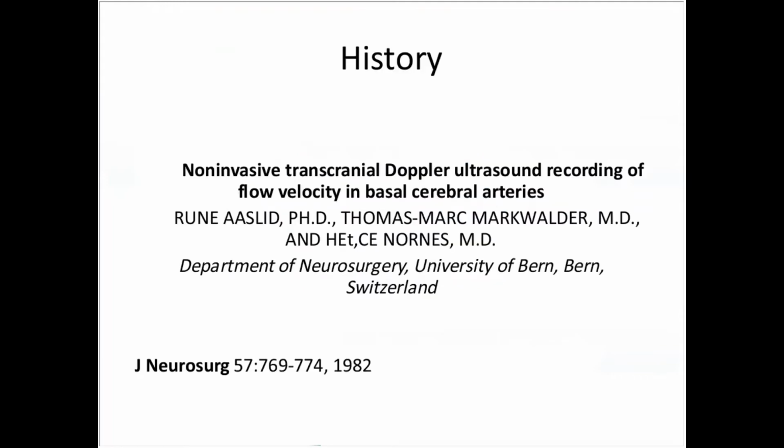A little bit of history. Dr. Rune Aaslid, back in 1982, founded TCD. He was sitting in his basement with a duplex machine. He placed the probe on the side of his head and found intracranial flow. He was the first to publish normal values for the anterior circulation.